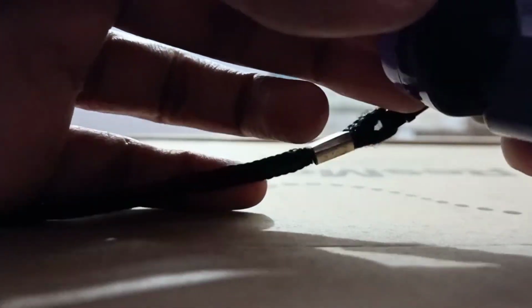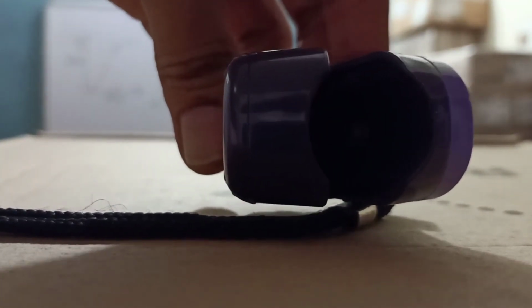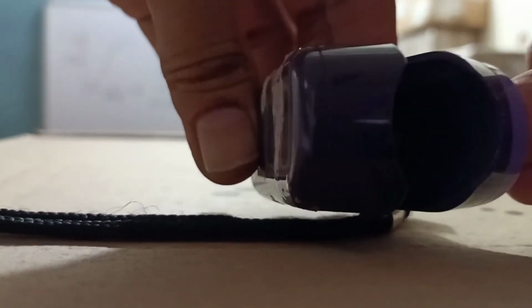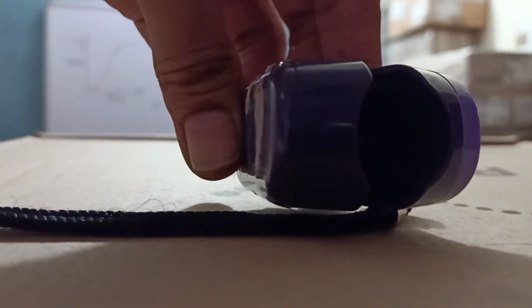And if you can see what happens when you put the finger on, there is actually a light flickering inside. Maybe you can appreciate it here, you can see. And that is actually the wavelengths which are sent in a pulsatile manner, which detect the level of the oxygenated blood as a color code and display that as a digital number.